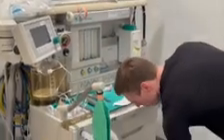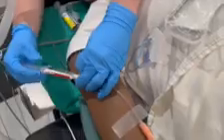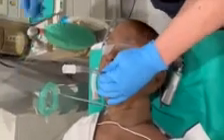Today, we'll be walking through the steps of an appropriate setup in the operating room to prepare for a general anesthetic induction. We will begin by showing you how to prepare the room, how to get the patient situated, managing the induction sequence, and ending with direct laryngoscopy and airway securement.